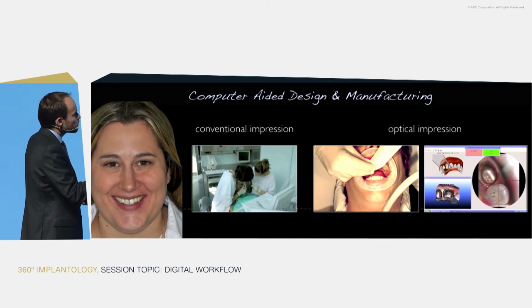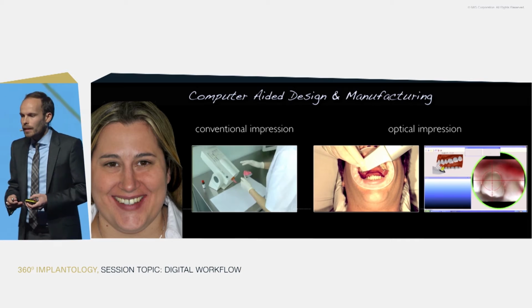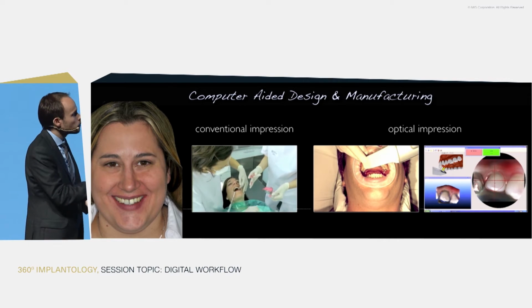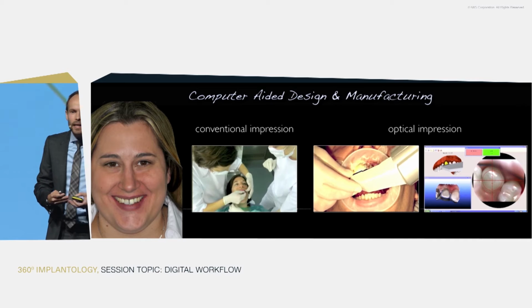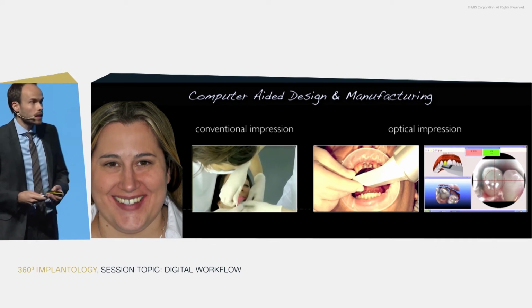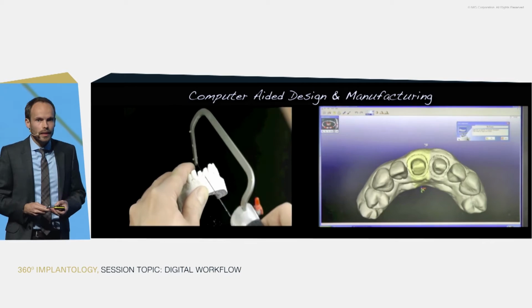And you see all the things that we have to do ahead of time, preparing the teeth, cleaning the teeth. All of this has to be done on both sides. But for sure, the clean approach of an optical impression compared to this stressful approach, a little bit highlighted in this patient, is something that the patient appreciates a lot. But you see the differences getting even stronger and more pronounced once we are on the lab side.